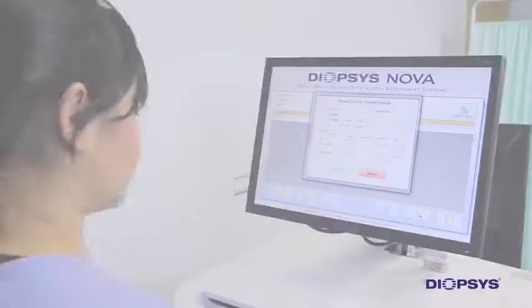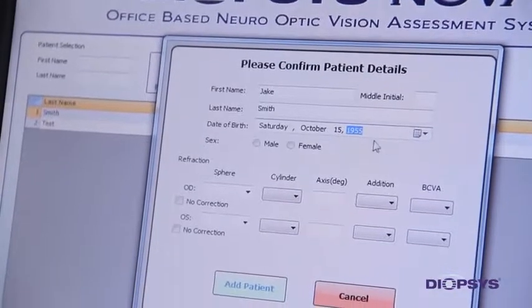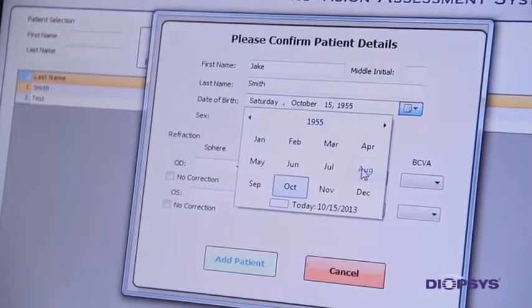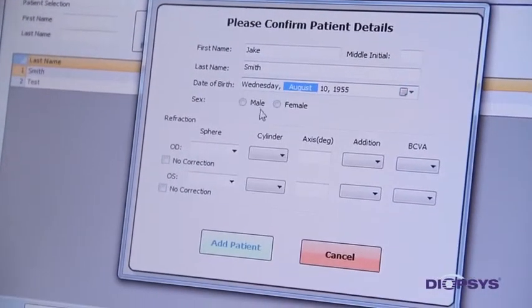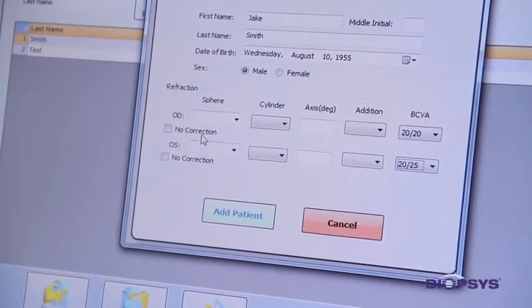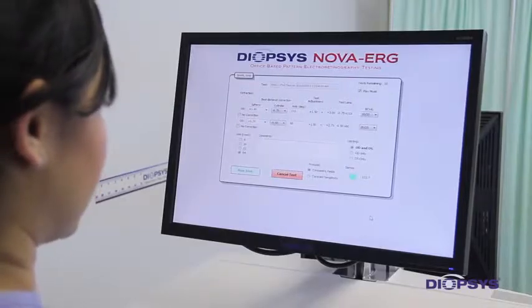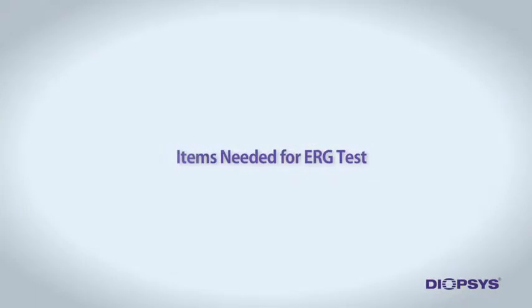Begin by entering all patient information into the Diopsis NOVA software for those patients who will be tested for the day. Later, as patients are brought to you for testing, you will be able to click on the patient's name and proceed directly to patient preparation and with running the test. This will help with patient flow.